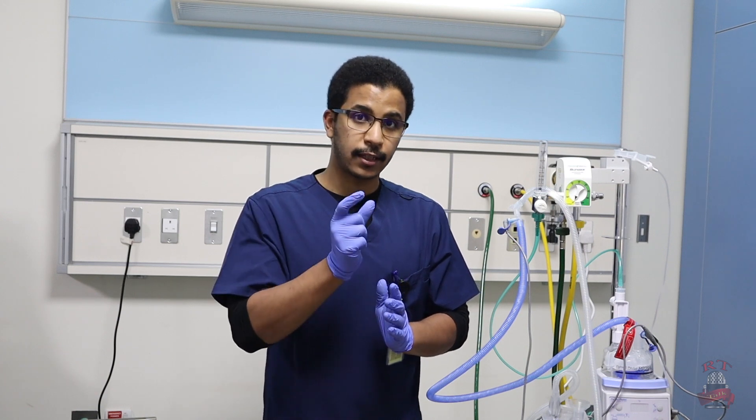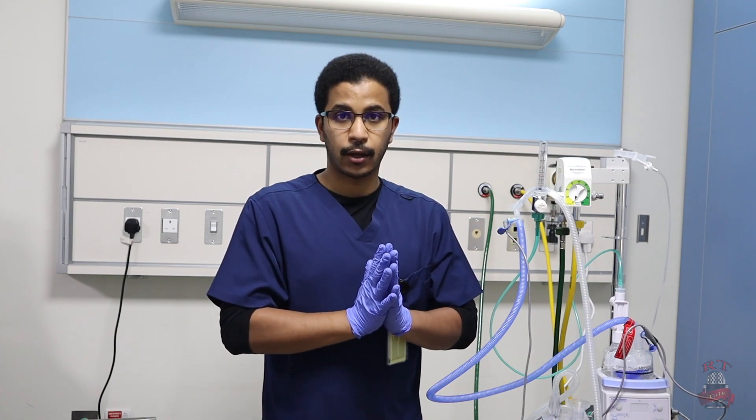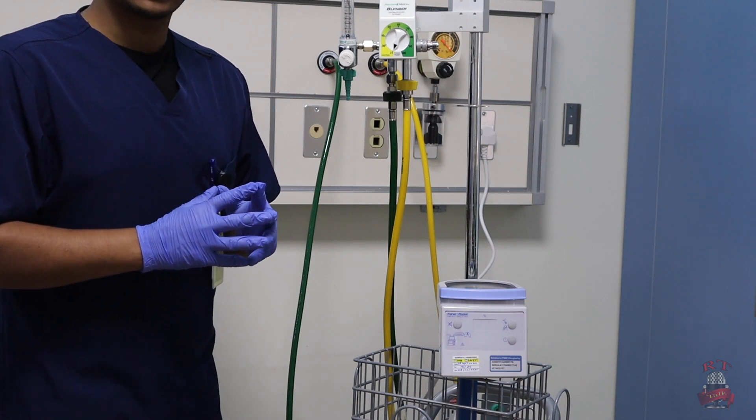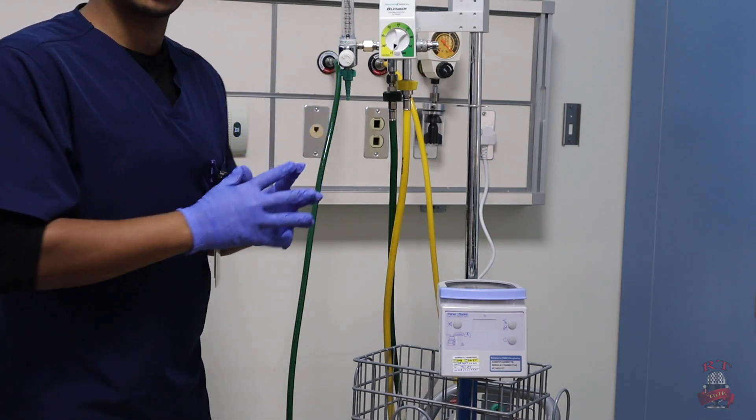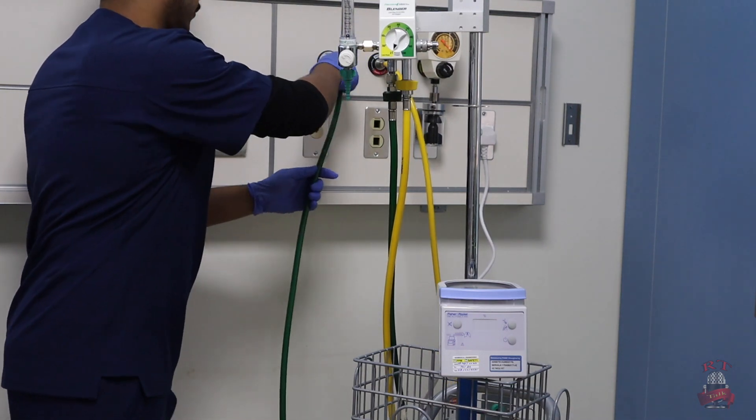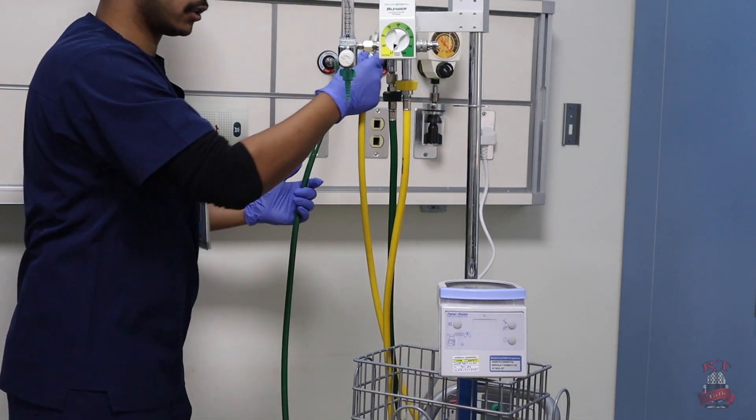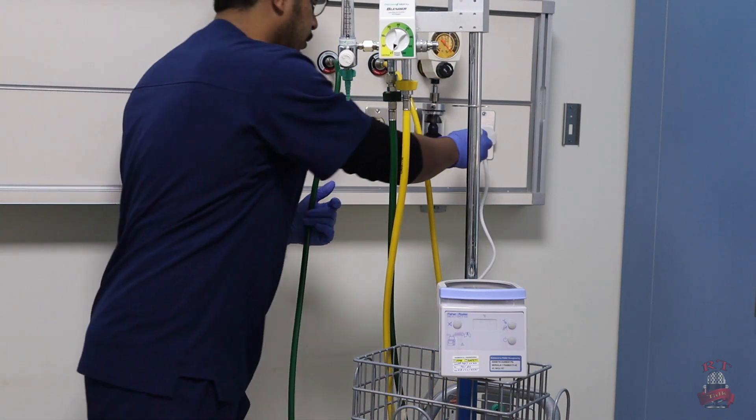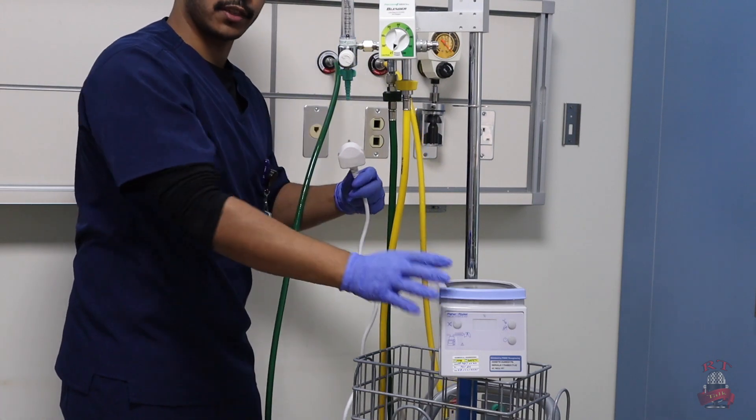First, after you collect what you need like oxygen blender and your bubble CPAP system kit and the nasal prong or the mask or what we call the interface, we will see how to set up. Now we will start. In the beginning you will connect your oxygen blender, the oxygen air, and the medical air, and your electricity for your humidifier.